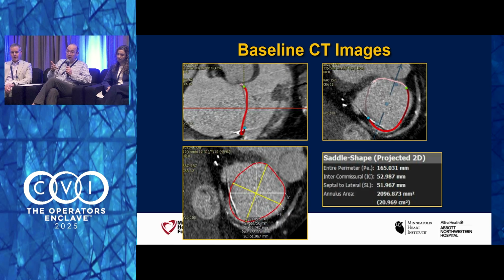But in my mind, this is a TTVR case. It probably can be managed with the commercially available devices, and we just have to be very careful with the RV perioperatively: pre-admit, diuresis, maybe inotrope, no beta blocker, strict post-operative management.